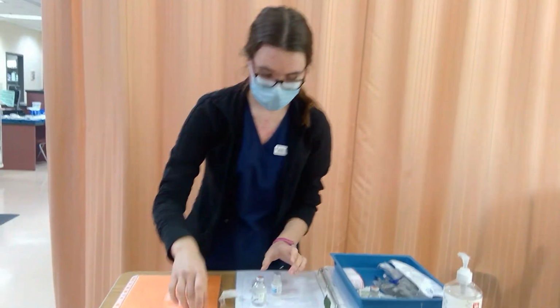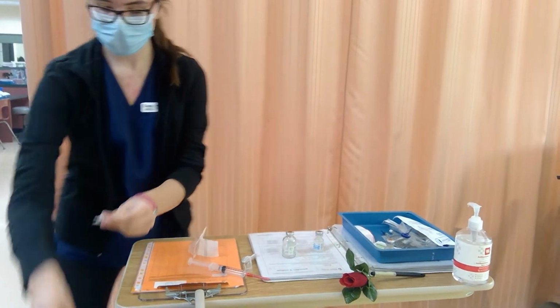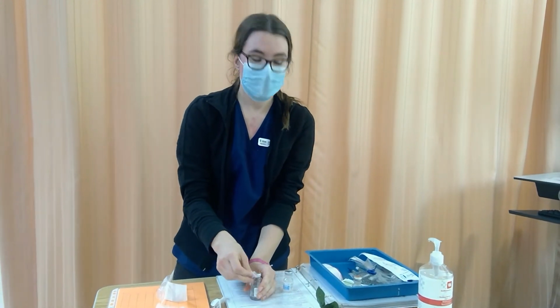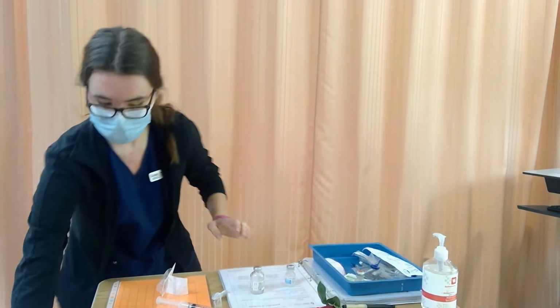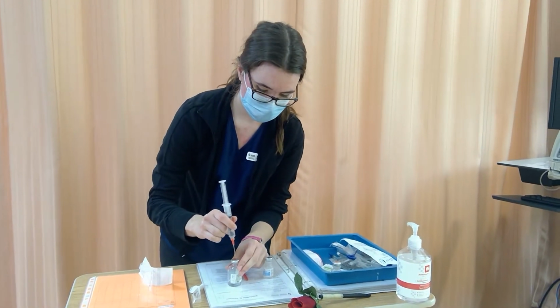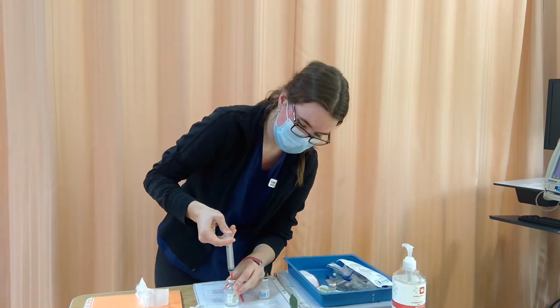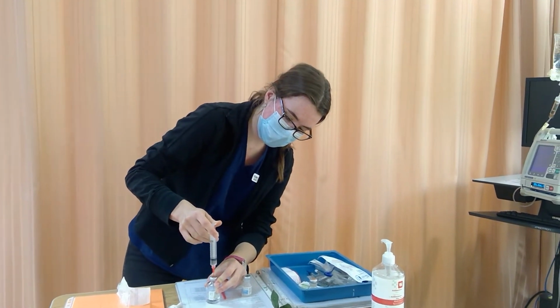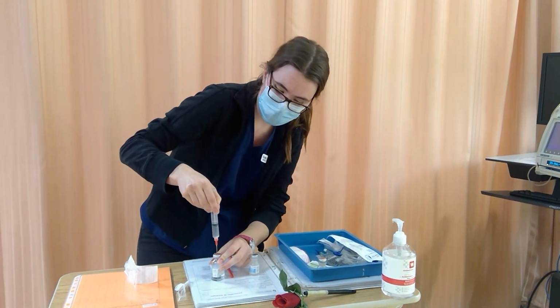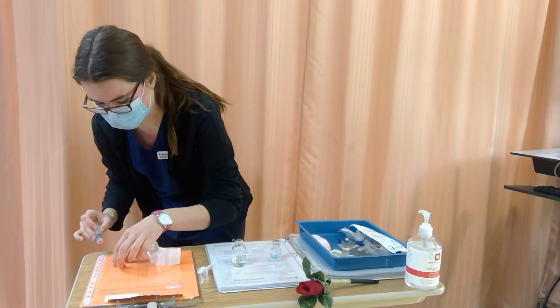I'm going to be inserting that into the penicillin. So I'm going to take my alcohol swab and swab the top of this for 30 seconds, and then let it dry for 15. Uncap this, insert my sterile water, and let some air come back, because we don't want to have that pressure build up in there and have it explode all over a bunch of people, right?